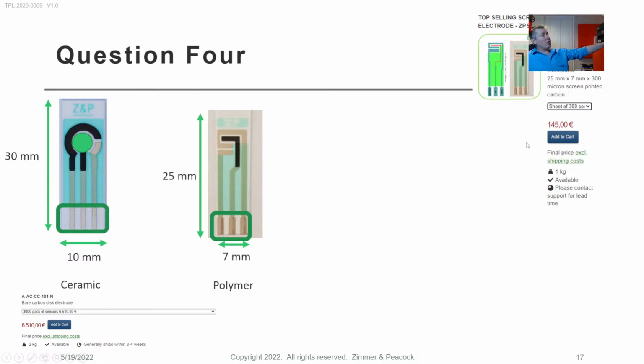Now, the reason that we're trying to make this hypervalue electrode so low cost is because I'm quite unusual in that I do have a background in high volume manufacturing of biosensors, and I know that a glucose strip would have something like 2 to 5 cents per cost.